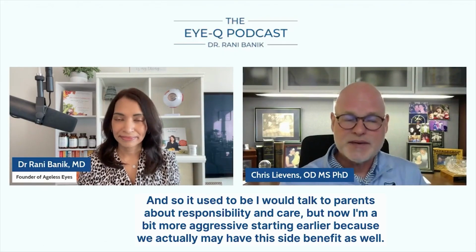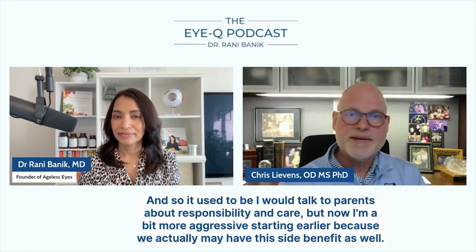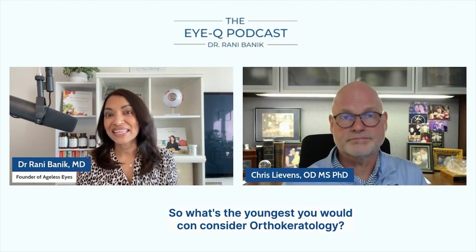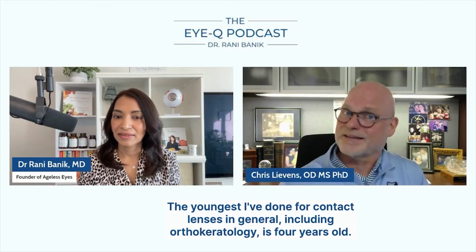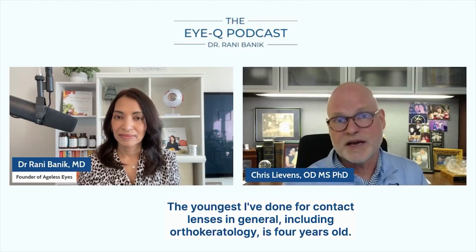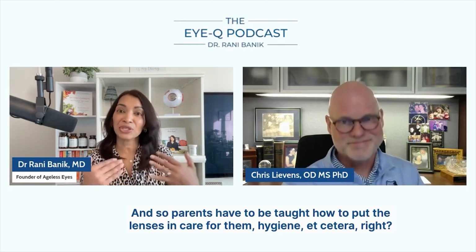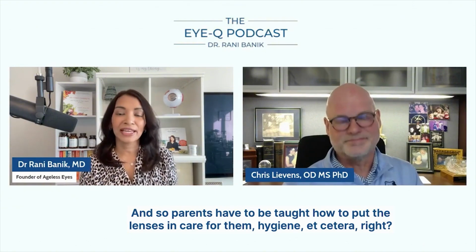It used to be that I would talk to parents about responsibility and care, but now I'm a bit more aggressive about starting earlier because we may have this side benefit as well. So what's the youngest you would consider orthokeratology? The youngest I've done for contact lenses in general, including orthokeratology, is 4 years old. Got it. And you have to be taught how to put the lenses in, care for them, hygiene, etc.